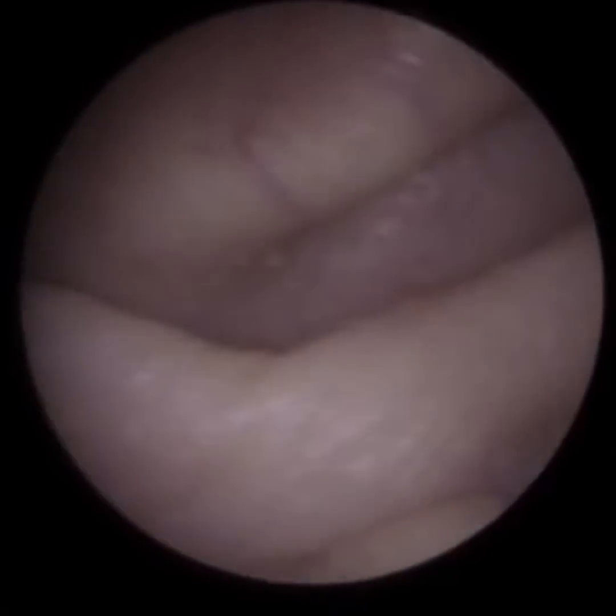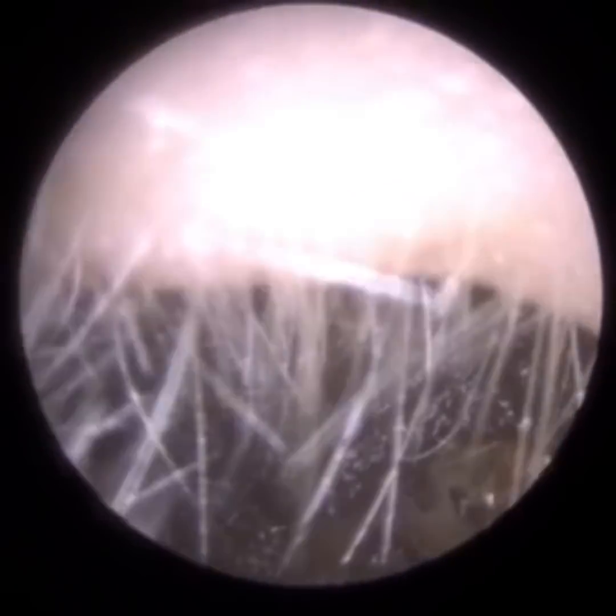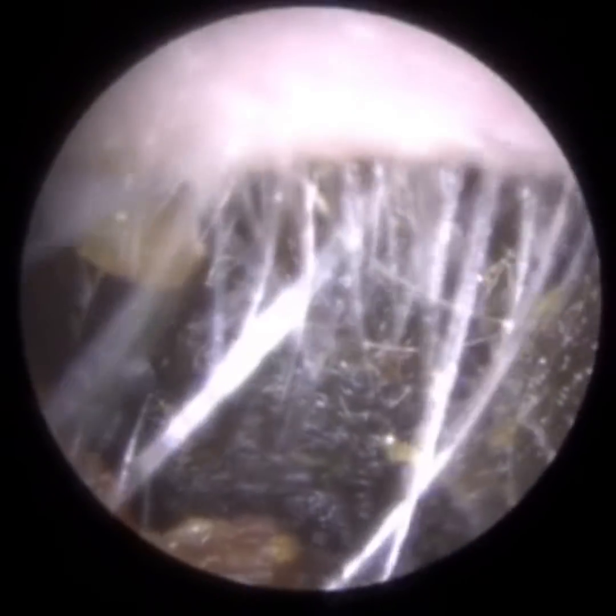This patient's got a dry plug of wax. It's quite aged — you can see by the colour it's oxidized near the entrance. There's a slight opening at the roof, so I'm going in with a Jobson horn.